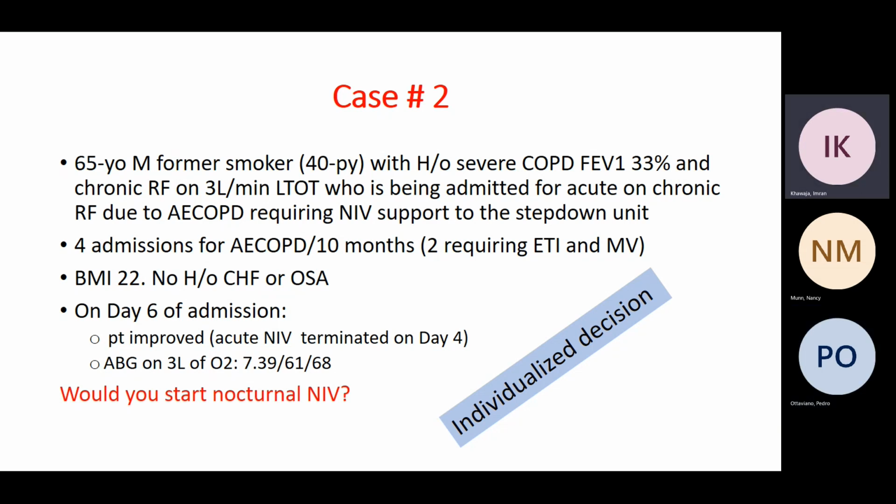Yeah, I agree with you. My point in the question is, if you looked into all these issues and were actually able to confidently say that these are frequent COPD exacerbations without any other confounding factors. I think what they have in the ATS guidelines is about the acute NIV: if you are successful in weaning your patients off it, sometimes you will have people who stay in the hospital for days when you stop the daytime and especially the nighttime NIV. The next morning they become slightly altered, maybe their pH is dipping, their CO2 is going up.